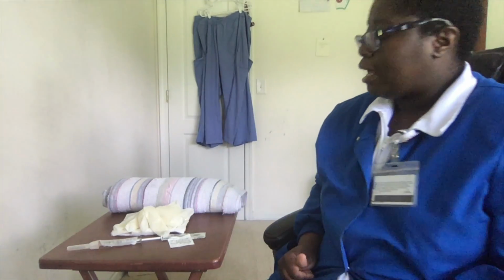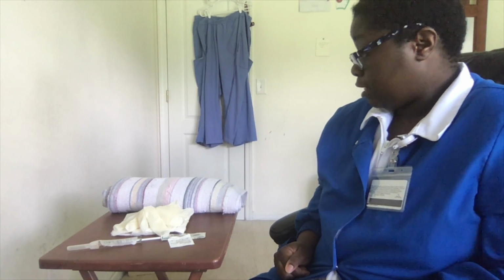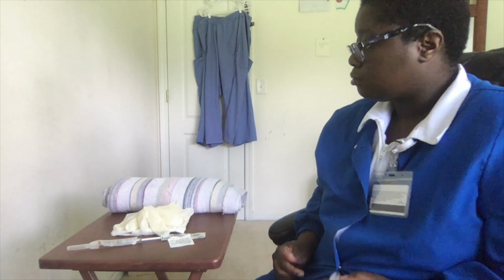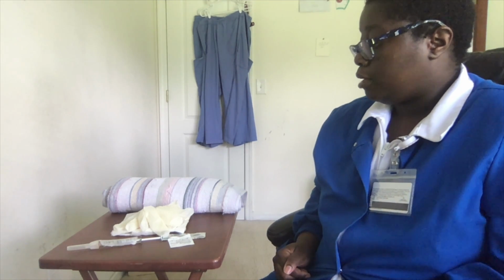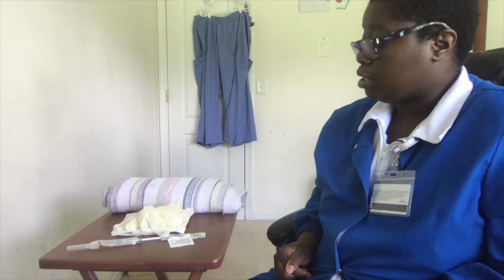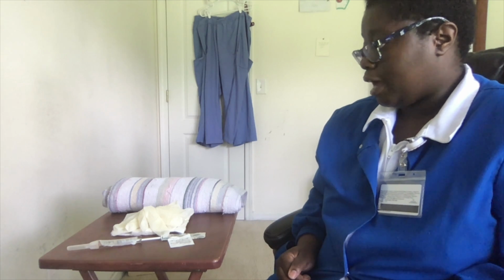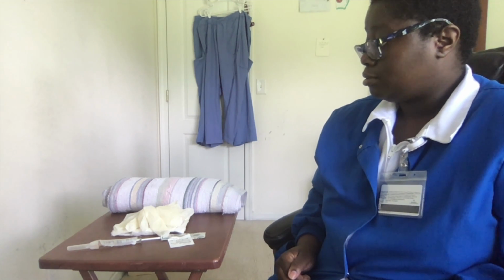Before we get started, where would you like to receive the shot this time? In the thigh? Okay. So what I'm going to do is raise the bed and lower one of the bed rails just so I have easier access to your thigh. Okay? Thank you.